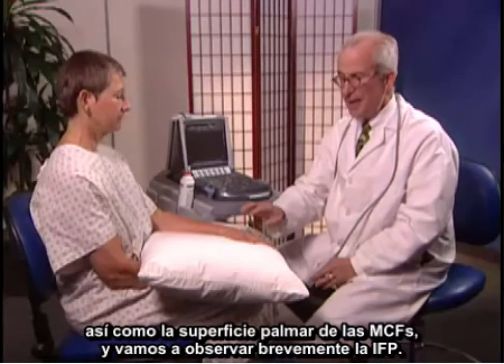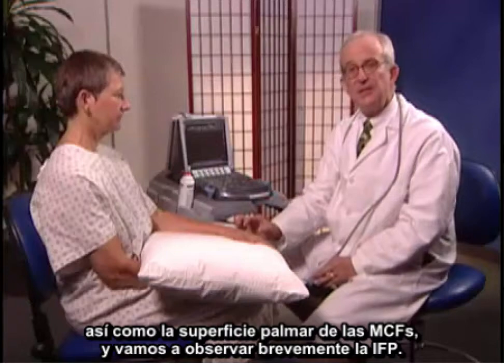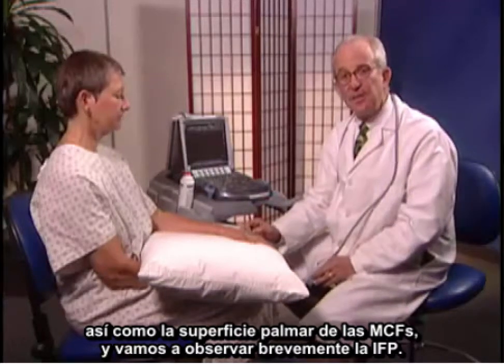I'm going to examine the MCP and PIP joints now. We'll be looking at the dorsal or extensor surfaces as well as the palmar surface of the MCPs, and just take a brief look at the PIP.